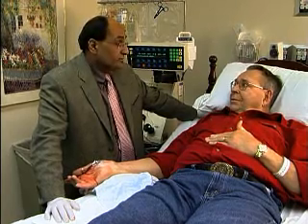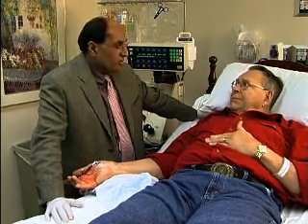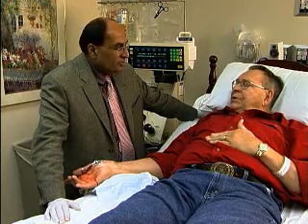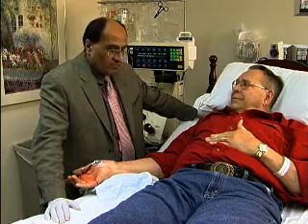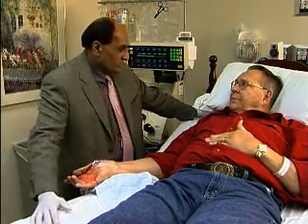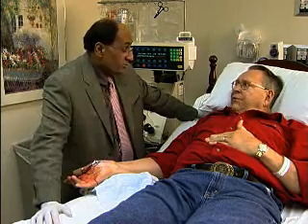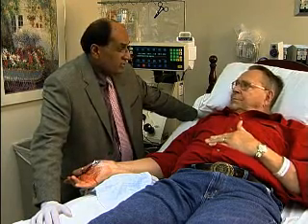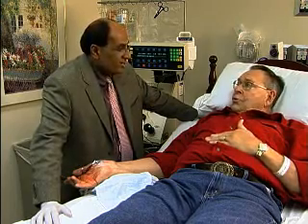You were getting 3 times a week initially. Yes. And then gradually we decreased the frequency, and now you're getting how often? Once every 2 weeks. Okay. And we've been using the artery as an access for all these years. Right. Every year. Right. And have you had any problems with that? Not at all. Did it hurt? No, not at all.